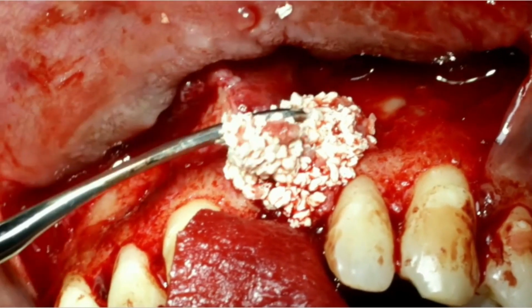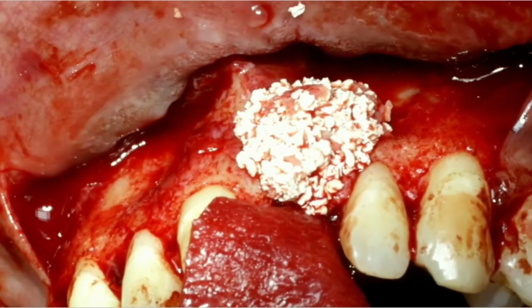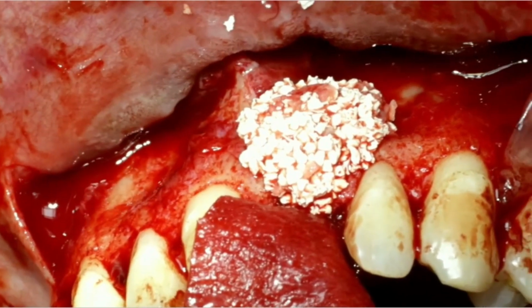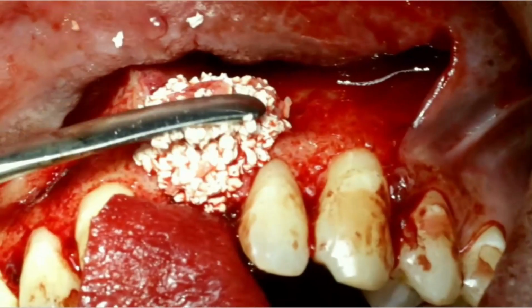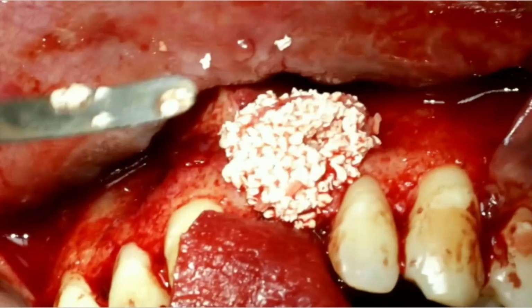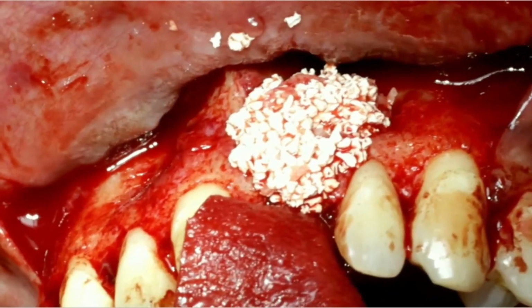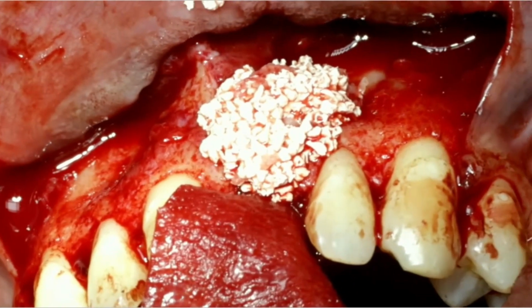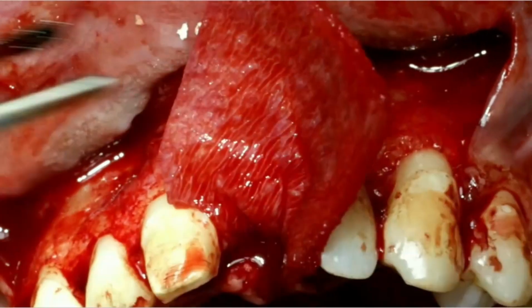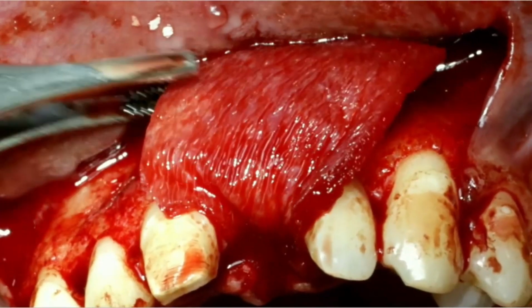We make overcorrection to compensate for the amount of the future bone resorption. Adaptation of the collagen membrane and fixation of it with pins.